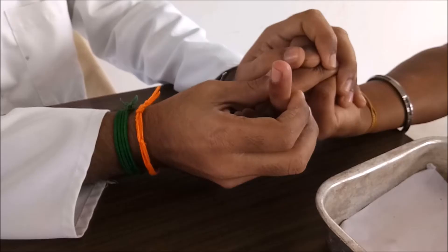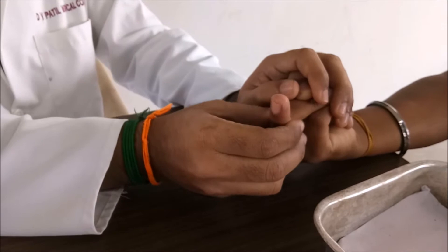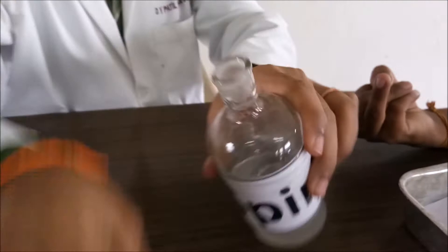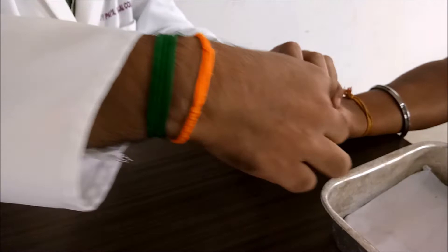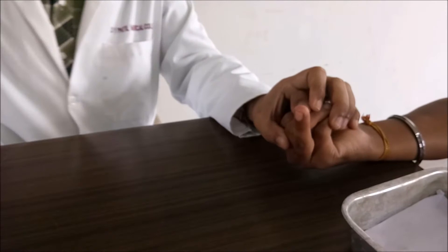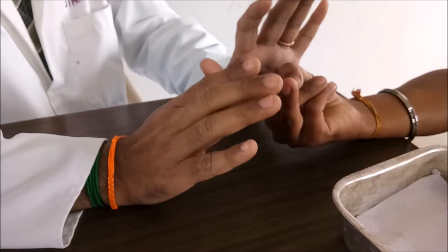Now you have to do gentle massage. Don't do vigorously. Gently, you just warm the particular finger like this. Once you have done it, take the spirit cotton. Wipe towards upward movement like this. Once you have wiped, don't forget to discard this cotton swab to the dustbin. And you should not blow this. Just wait. It is automatically get dried up.